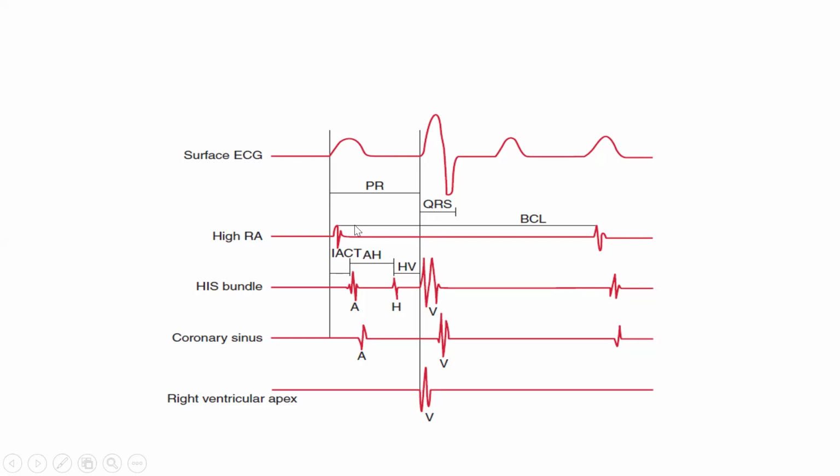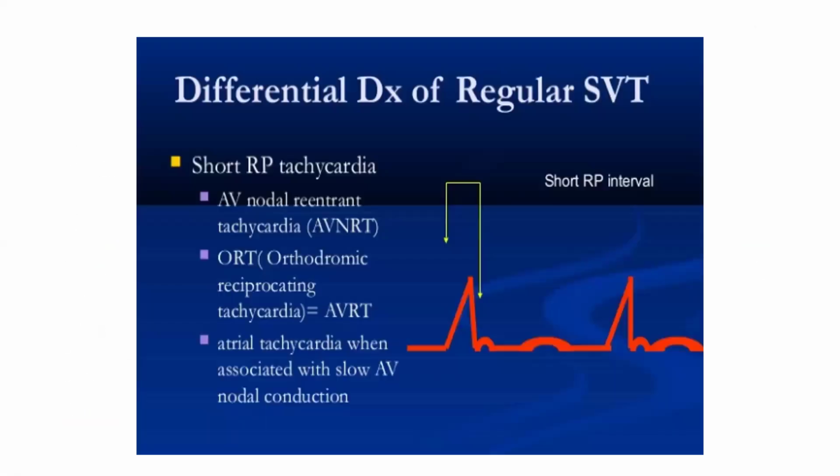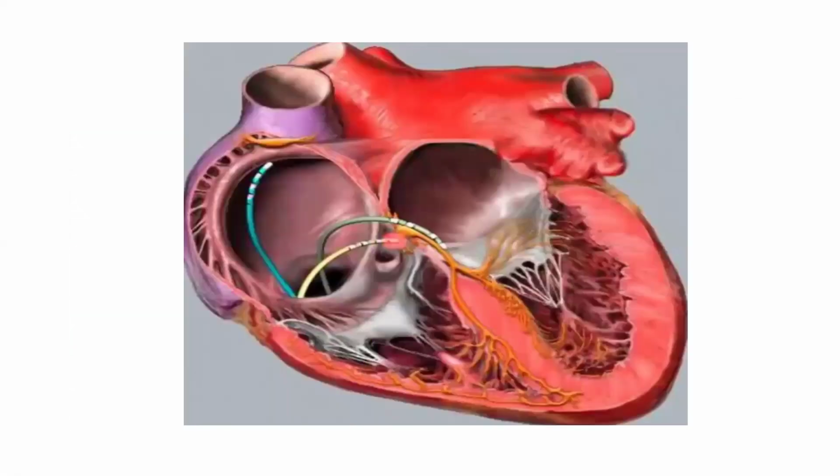Does the CS catheter also touch the LA or just the LV? No, look at this again. Let's go back to this picture. You can see the CS catheter here. It passed through the coronary sinus, right? So you can see this chamber is the left atrium, and this chamber is the left ventricle.